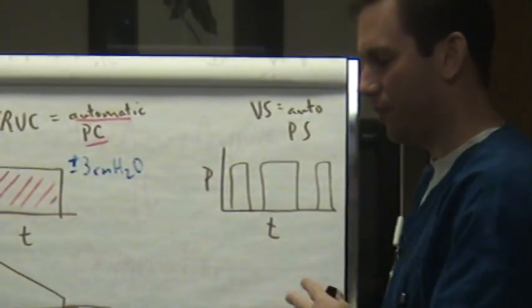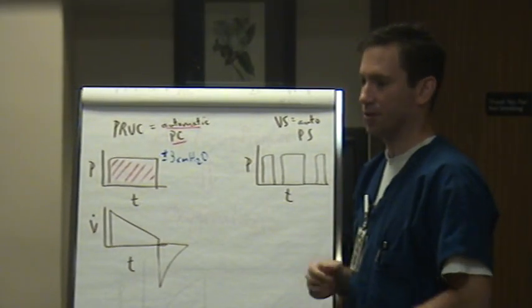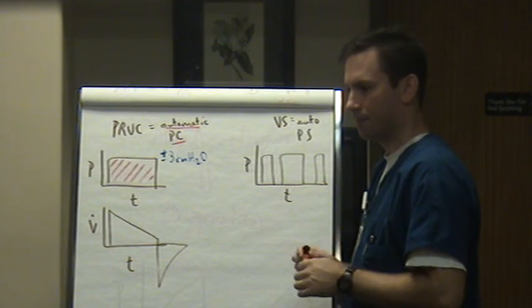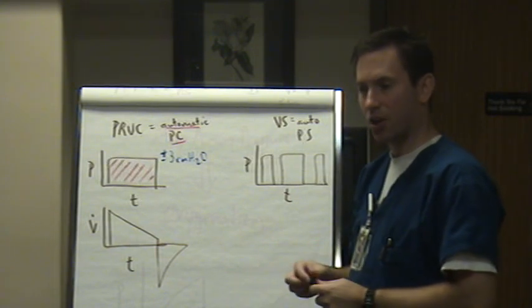So just in review, let's review that slide we just went over. Why would you think the therapist would call you to switch from a volume mode to a pressure mode? What would be their concern? Get too high of pressure. Good, too high of pressure, very good. What else might they see? The X-ray was looking bad. Good, a lot of collapse. Good. A lot more atelectasis occurring and whatnot.